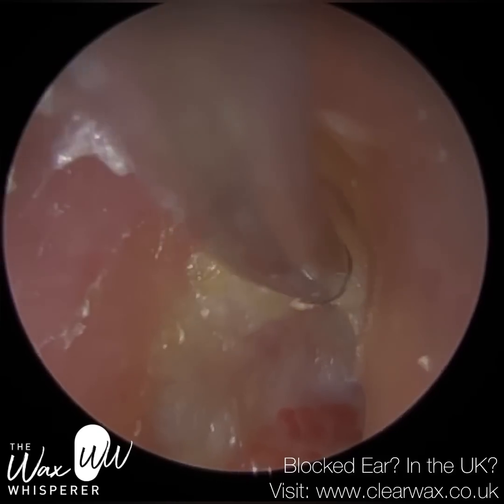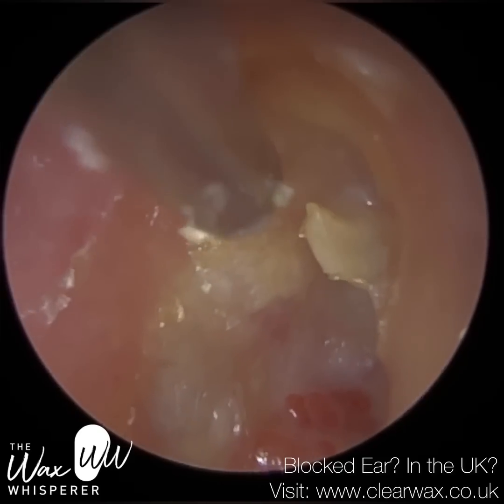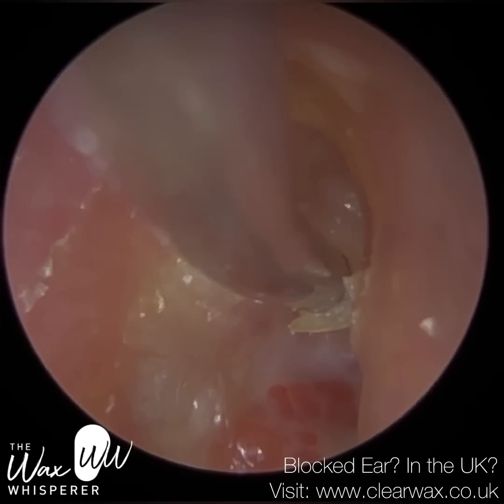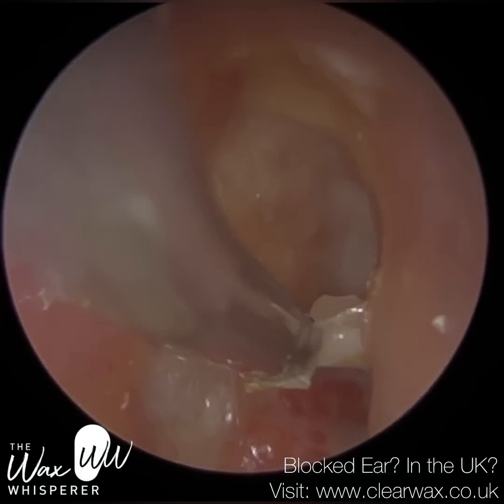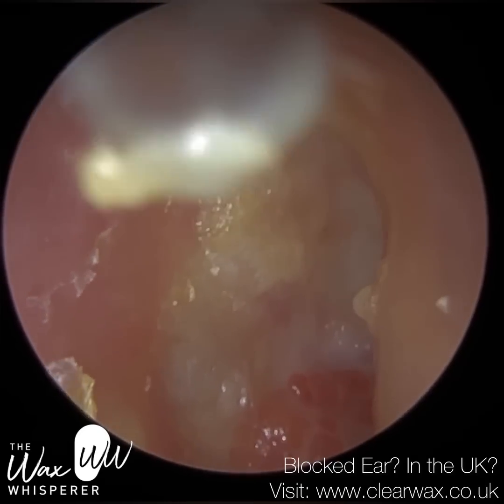You can see some damp skin here, just slowly peeling that away. The tail end of that has just blocked the suction probe there. I just gave it a little wriggle. The tail end of that is attached to the eardrum, so I'm going to be really gentle. As I'm bringing the suction probe away, I want to go sideways. I don't want to go towards the eardrum any further.